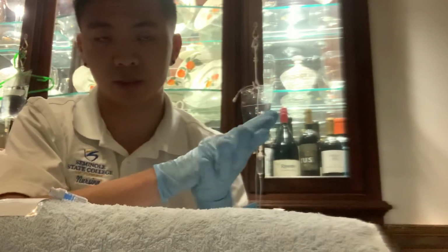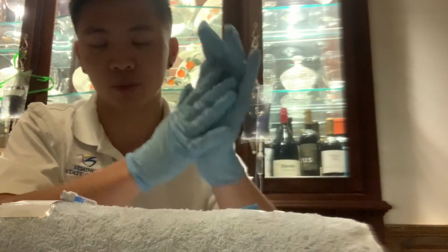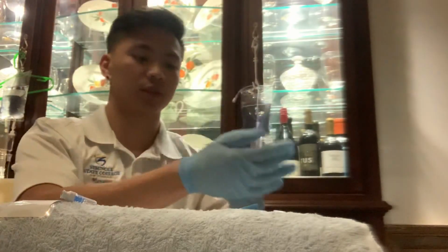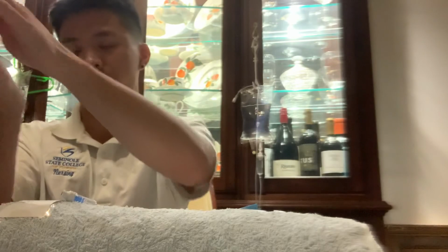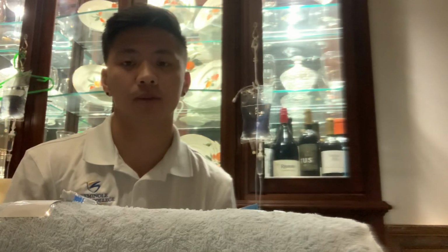I'll discard the supplies appropriately, and then I would just make sure the patient is comfortable, ensure the safety, and I would remove my gloves after I discarded everything to its proper place and perform proper hand hygiene. And that concludes my primary IV checkoff. Thank you very much.